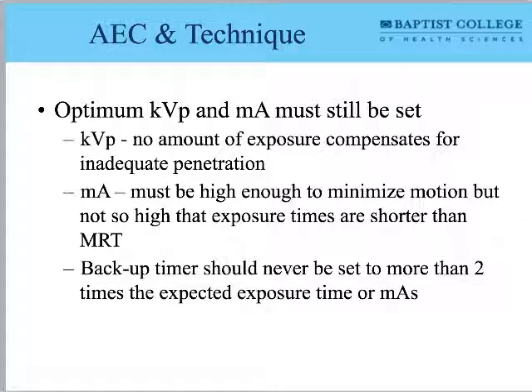He talks about this on page 412. He says at the bottom of the column on the left, it takes time, albeit thousandths of a second, for the circuit to detect and react to the radiation received. In English, what he's saying is, don't expose it faster than what it can take. So that's on one end of the spectrum.